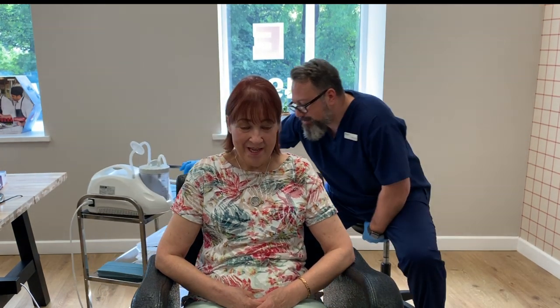Right, I'm going to come to the other side now. Now this one's a little bit wet, so it's a little bit more sticky on this side. It's a bit more painful, this one. We'll go nice and gently. It's okay, I'm brave.